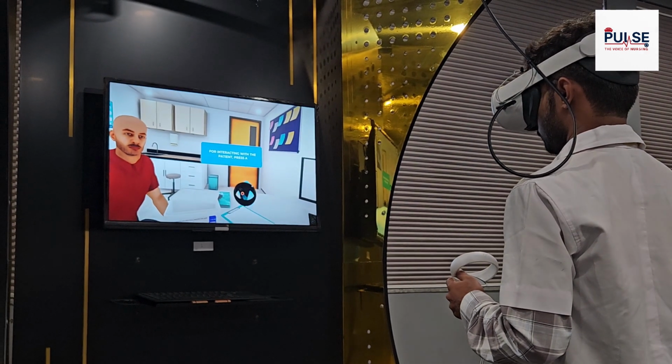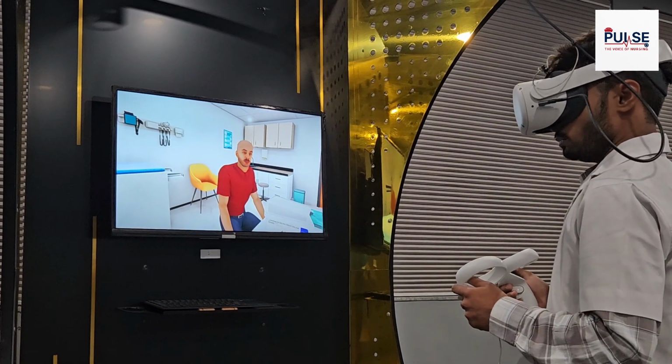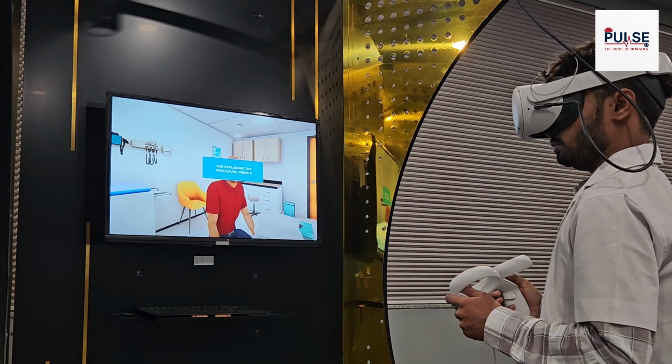For interacting with a patient, press A. Touch and hold the button to select. Hello, I am Dr. Sam. I will be assisting you today. Hi, doctor. For explaining the procedure, press A.